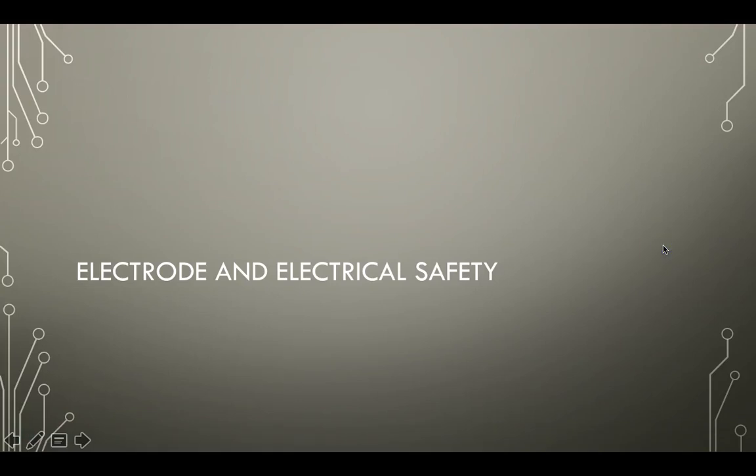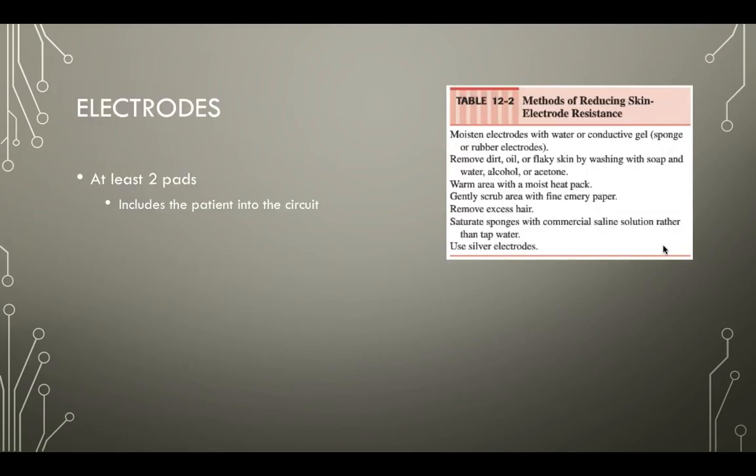Okay, so now we get to actually talk about how we position the electrodes in order to get the current into the tissue that we want, as well as talking a little bit about some electrical safety. So when we are creating a current, a circuit of the e-stim unit and the body, we need to have at least two pads because we need the current to enter and we need the current to be able to leave. And that includes the patient in the circuit.